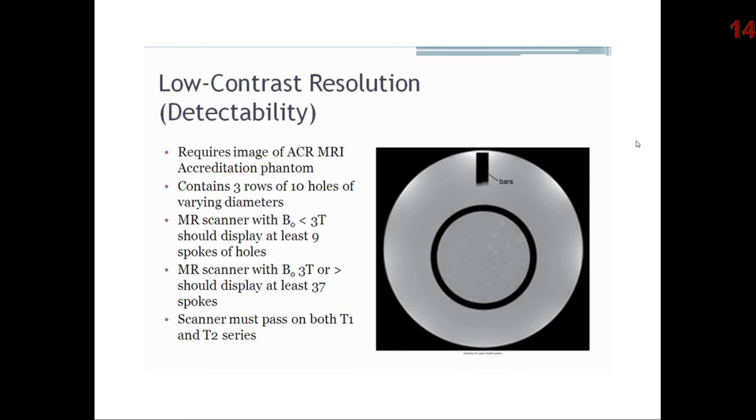The ACR phantoms contain 3 rows of low contrast objects that radiate from the center of the phantom in a circular pattern. Each row contains 10 holes of different diameters, from 7 millimeters to 1.5 millimeters. Slices acquired at 4 locations within the phantom can provide contrast values.